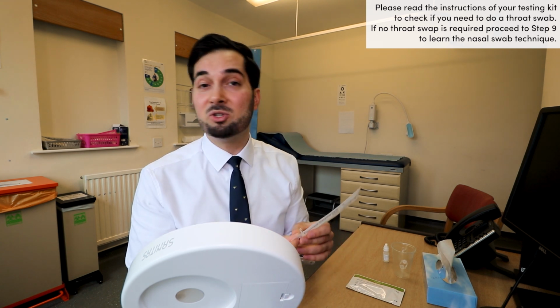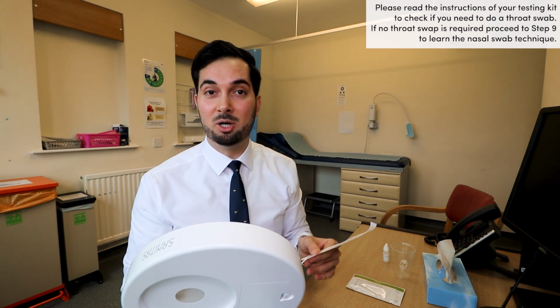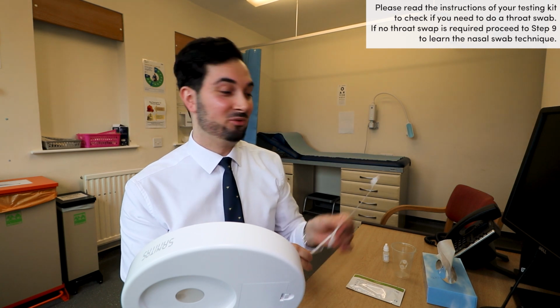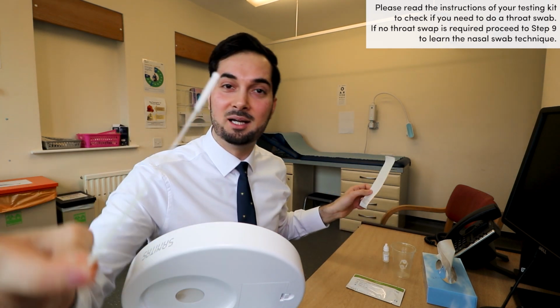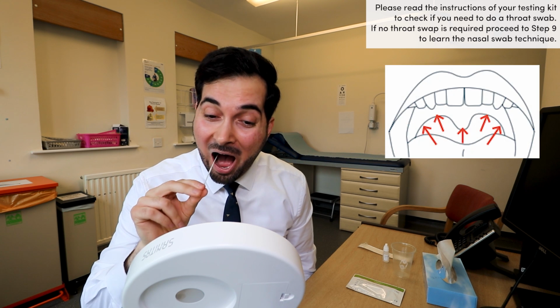So excuse me for doing this on camera. I'm not sure how much you're going to see, but I will do it on camera for you, and I'll have a diagram pop up. But yeah, just excuse me for doing this on camera. So I've got this, and I've got the fabric end right here. I'm holding it from the plastic end. Open your mouth, and then just rub it 4 times on each side.